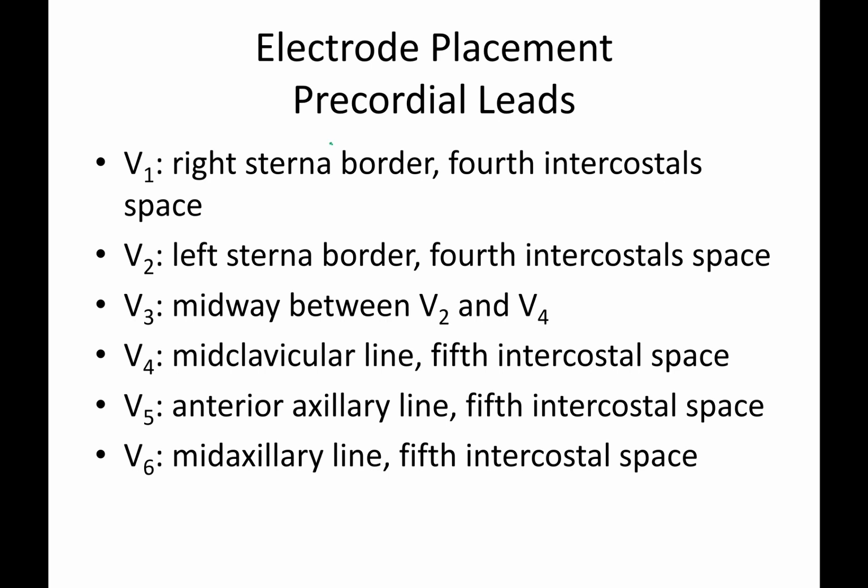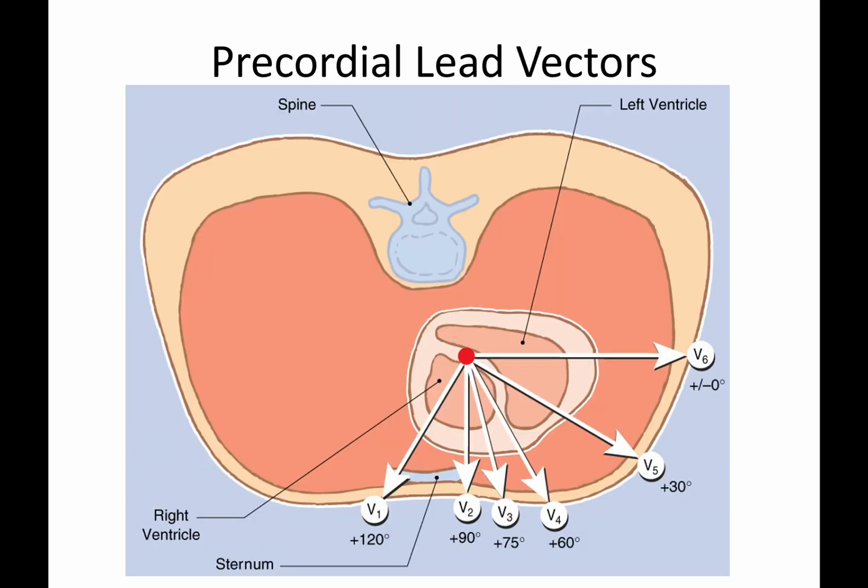I will mention, though, that I forgot my L here and my L here for sternal. But please keep these in mind. What really matters is this photo. And this demonstrates exactly what sections of the heart this is looking at. Now, of course, this is your right side, this is your left side, this is your left ventricle, and this is your right ventricle in here.